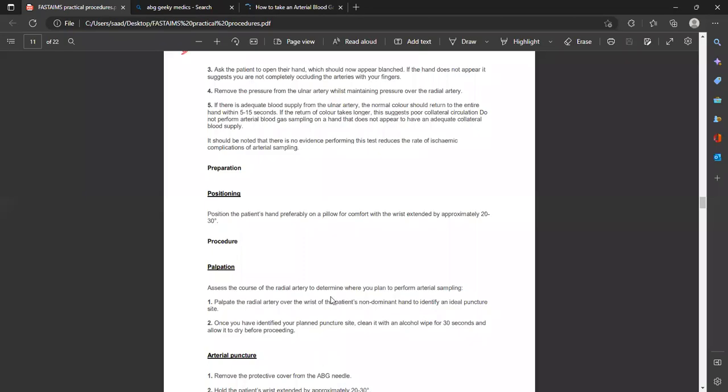Okay, watch this video and see how it's done. See how they do the modified Allen test, how they perform this ABG sampling, and before pricking, how they give a warning: a sharp scratch is coming. You need to see these things and the use of the sharps bin. So watch it.